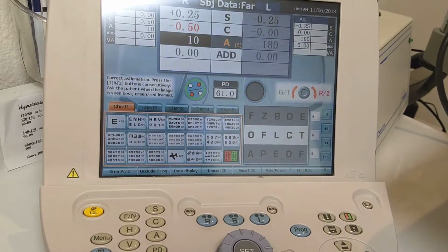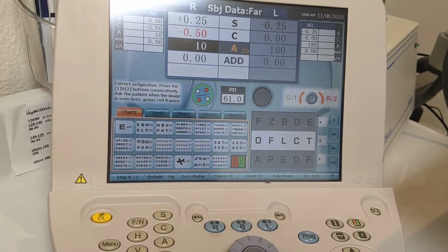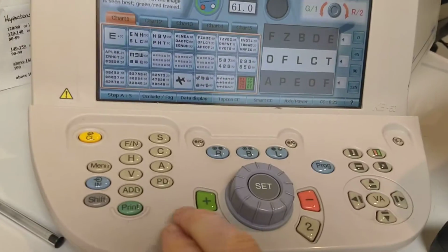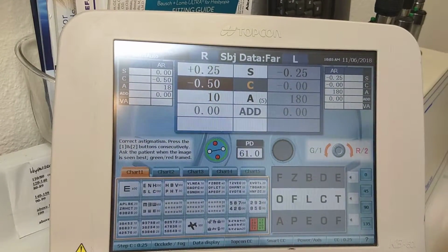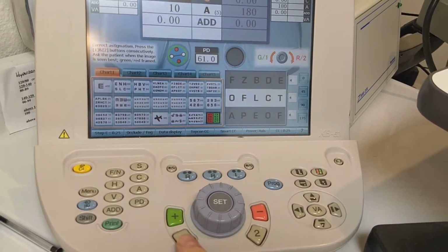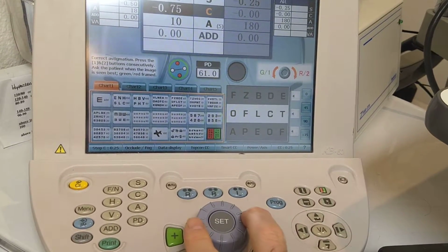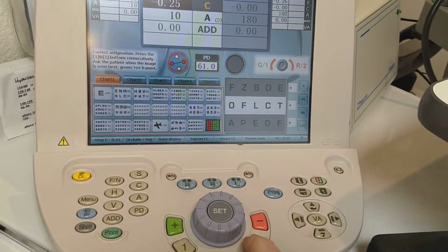Now sometimes I tell people that you should see a red ring around the edge of the lens or a green ring, and they're like, I don't know what you're talking about. So then I just continue my numbers 1 and 2, since they can't tell those colors. And then you go to cyl. Let's say you want to make it a minus and say which is better, the green or the red. So again, you just turn towards what they say. Let's say green. Which is better, the green or the red?